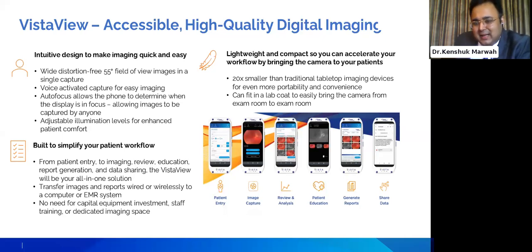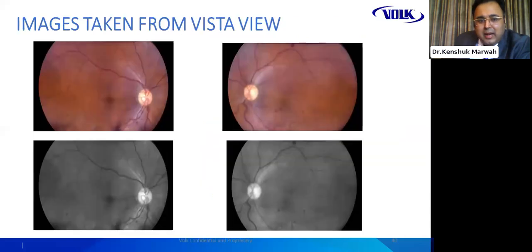And like I said, again, India is the diabetic capital of the world. This is the biggest fight against blindness that all ophthalmologists are doing these days. And patients need to be aware, because patients don't know the severity of the problem. Once they see images like this with blood on the fundus, which in this case is a moderate diabetic retinopathy, and you tell the patients to be cautious at this time, as you can show the colored fundus, even the red-free photos can be done.